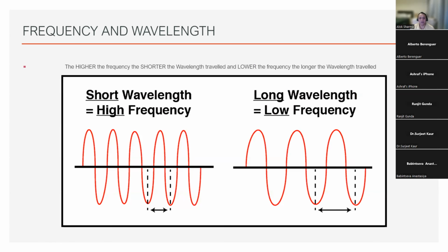Why is this so important? So I'm just going to give you an example that when you use a higher frequency, what happens with sound waves is they tend to travel a smaller distance. So if you look at this, this is a higher frequency. My apologies. So this higher frequency, let's assume that we have a probe.